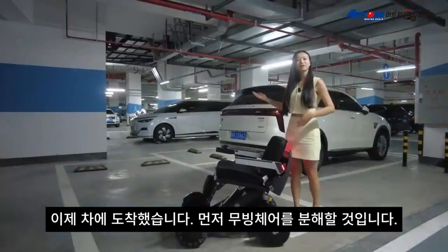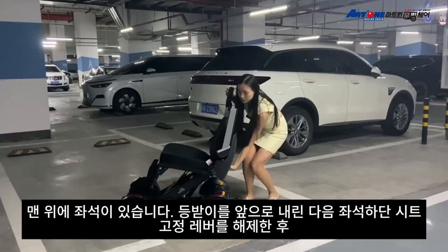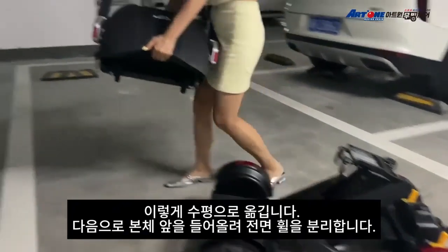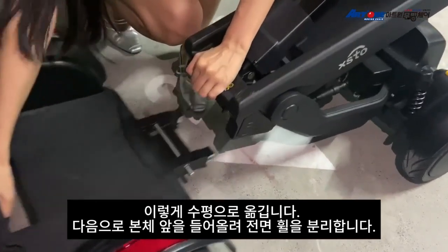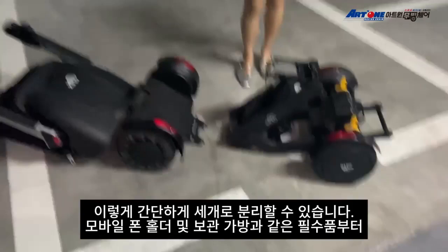I've arrived at the car and I'm going to take the wheelchair apart. First, on the top there is a seat — put the back rest down, then move the seat horizontally. That's one piece. Next, put the front pedal out. Now there are three pieces total.